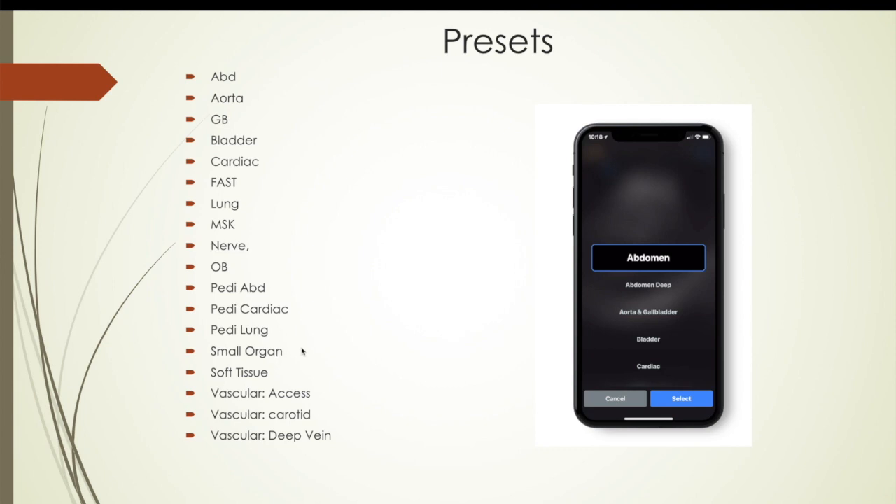There are 19 presets and you can adjust them — either for that patient or permanently save them as your own. Abdomen, aortic, gallbladder, bladder, cardiac, FAST — just all these different presets. They make the software so easy to use. It truly is incredible. I thought the Terrasan was the easiest ultrasound I'd used, but the Butterfly is even better.